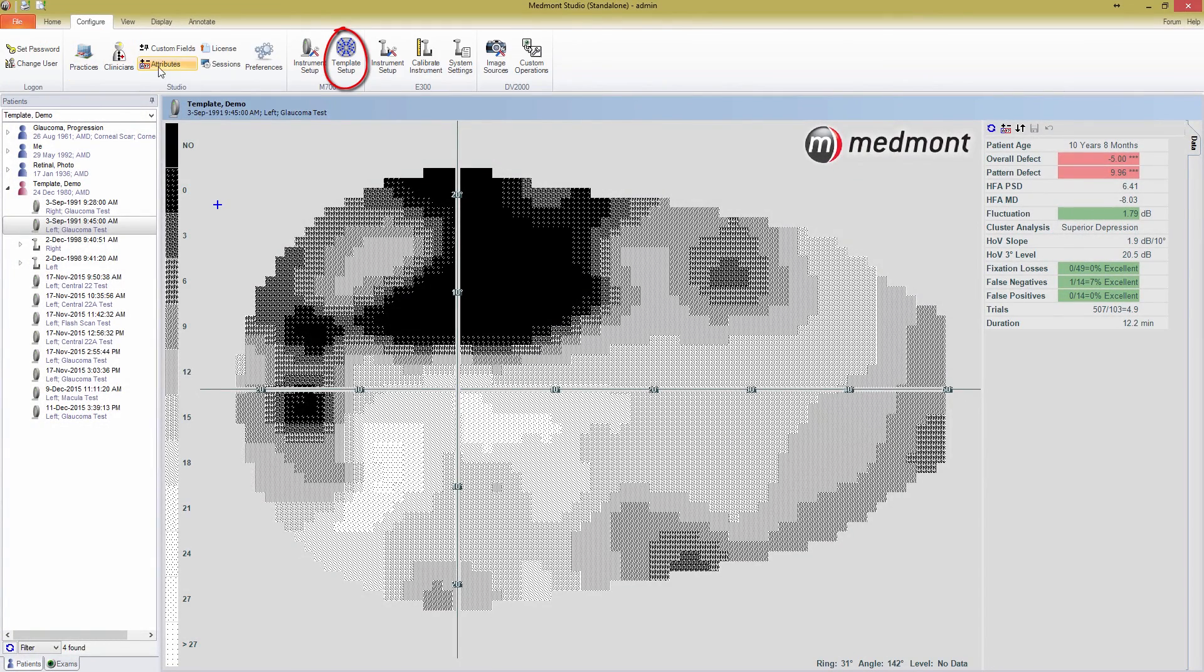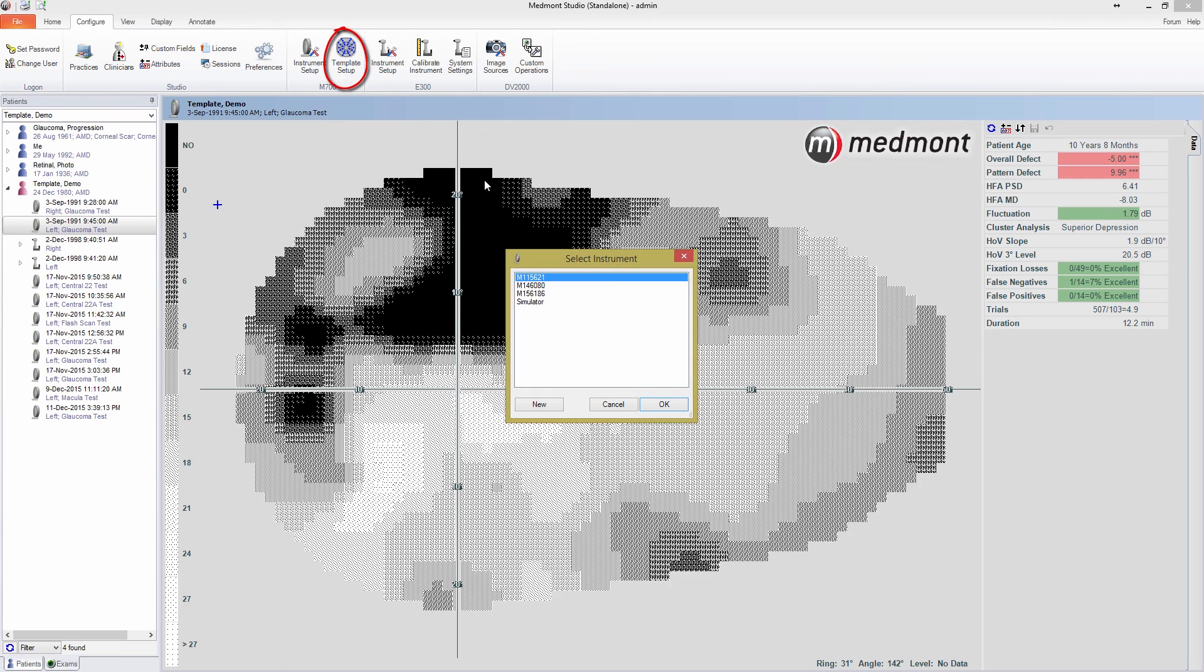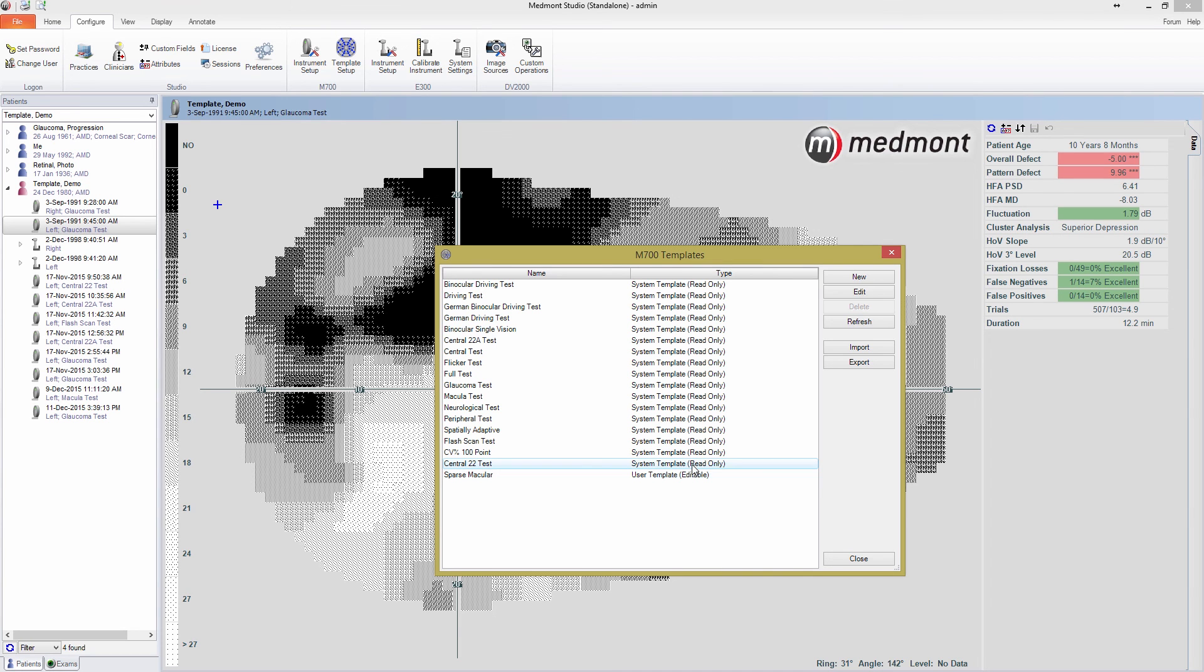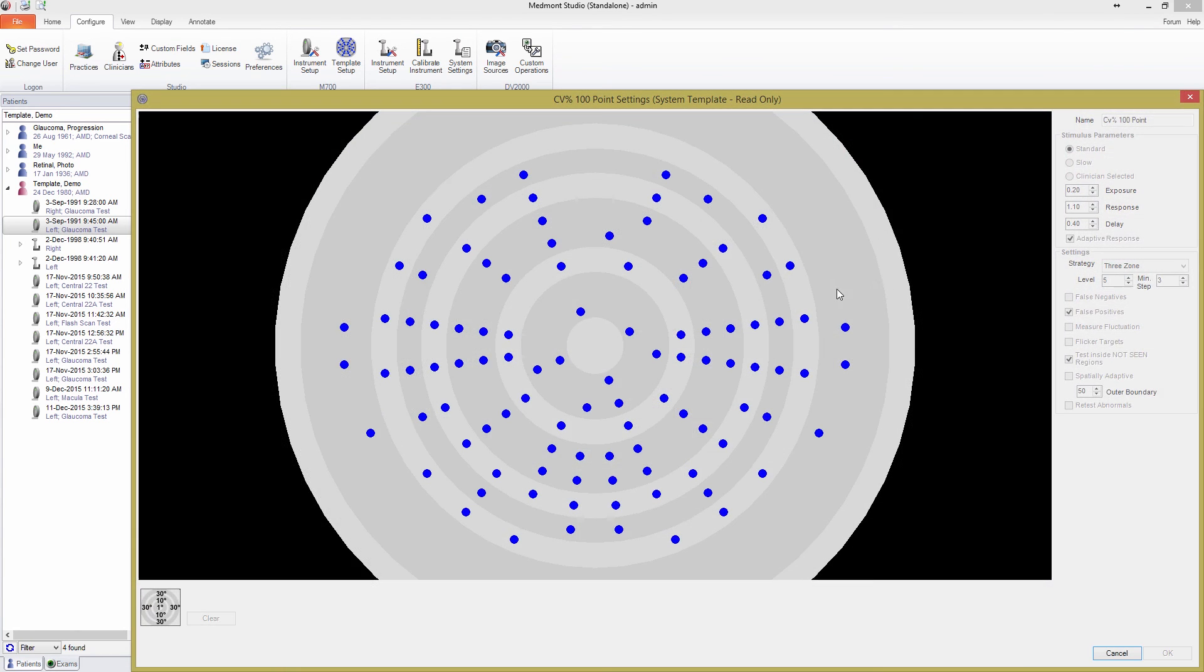Press on this, and you'll see all of the templates you have available. Whereas the test window is the best place to build new templates from, if you need to delete or modify your pre-existing templates, this is where you need to be. You can see that the test we just built is at the bottom of the list. It is the only user defined template, and as such, the only one we can edit. Medmont Studio doesn't allow you to edit the built-in templates to keep the standards consistent.